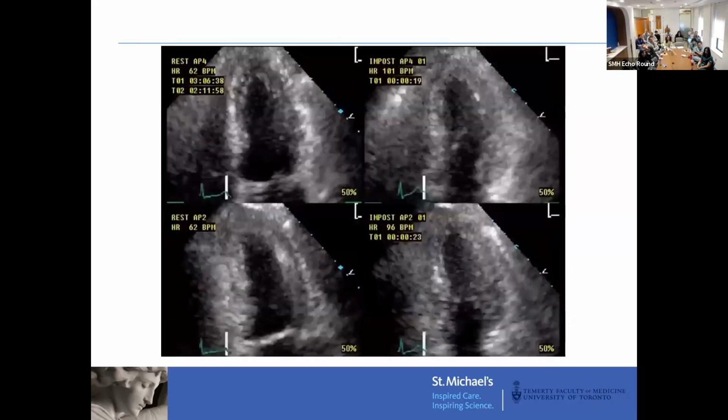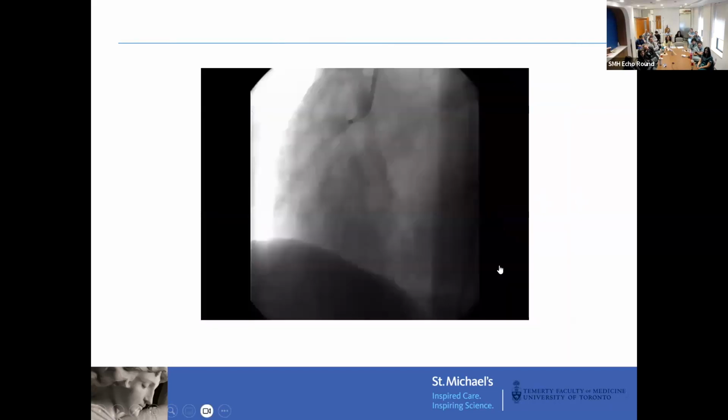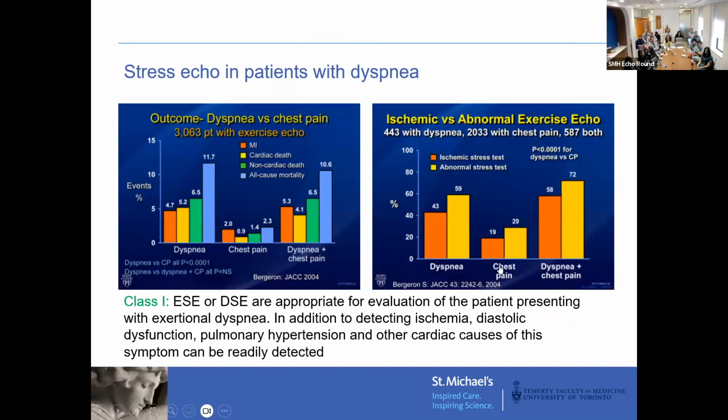That's why in our institution, since the beginning of time of doing stress echo, we always emphasize having an interpreter in the room. In fact, way back when, we used to do this by video tape. With video tape, we usually go back and forth, and actually you have a lot more images. Taking a lot of images in the background is also very helpful, because you can have multiple loops. I think we do it very well here, but many institutions only read from one frame, which I'm very afraid of, creating false positive or false negative studies for that reason.